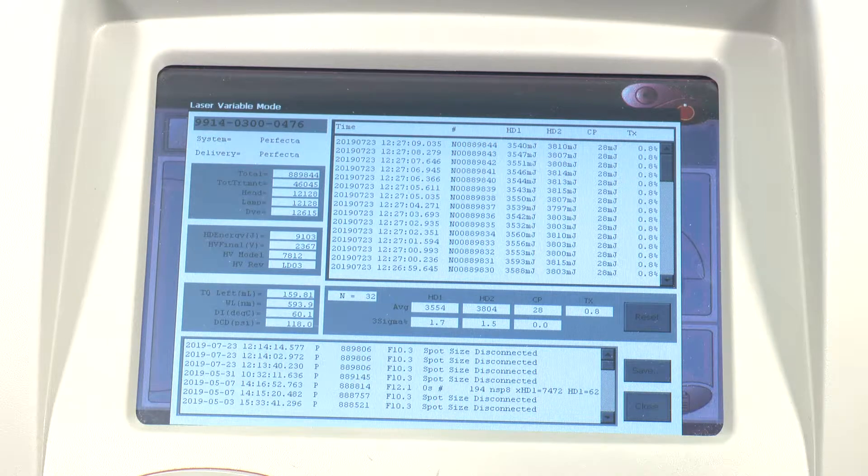This was actually just serviced in February by Candela. In February they rebuilt the laser head, they replaced the lamps, they replaced the die kit, and they put a new fiber on. So as you'll see from the head, the lamps, and the die kit, there's just a little over 12,000 shot counts on each of those. Same would go for the fiber — the fiber is brand new as well.